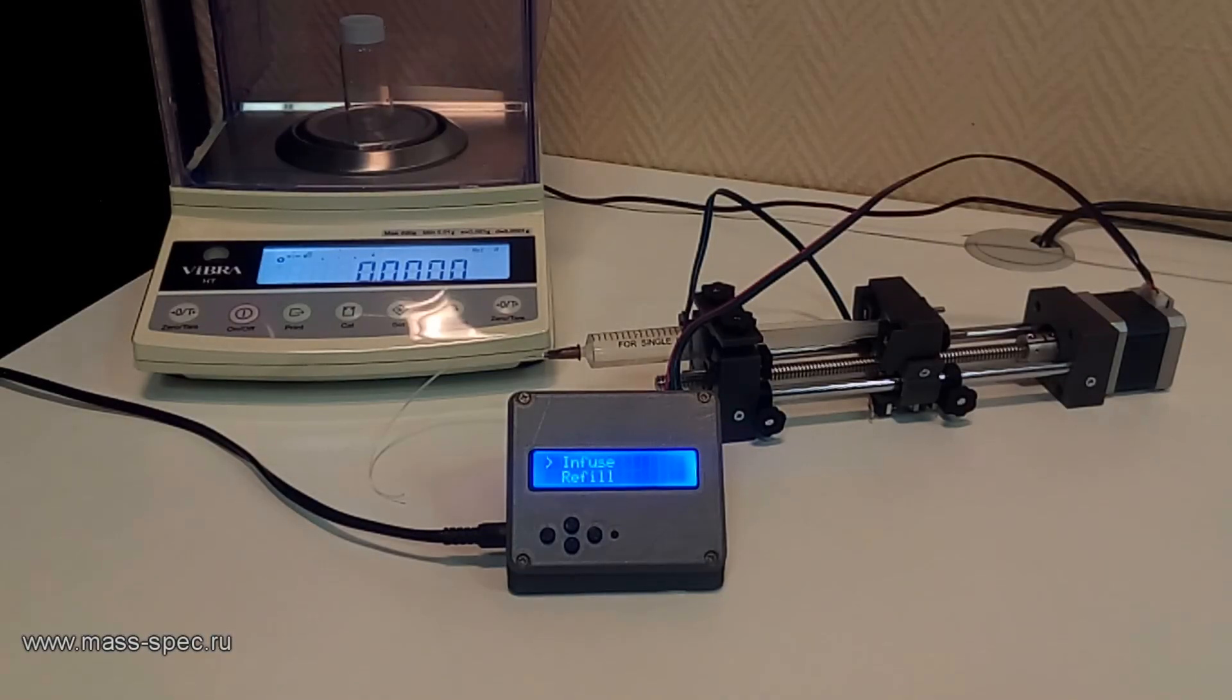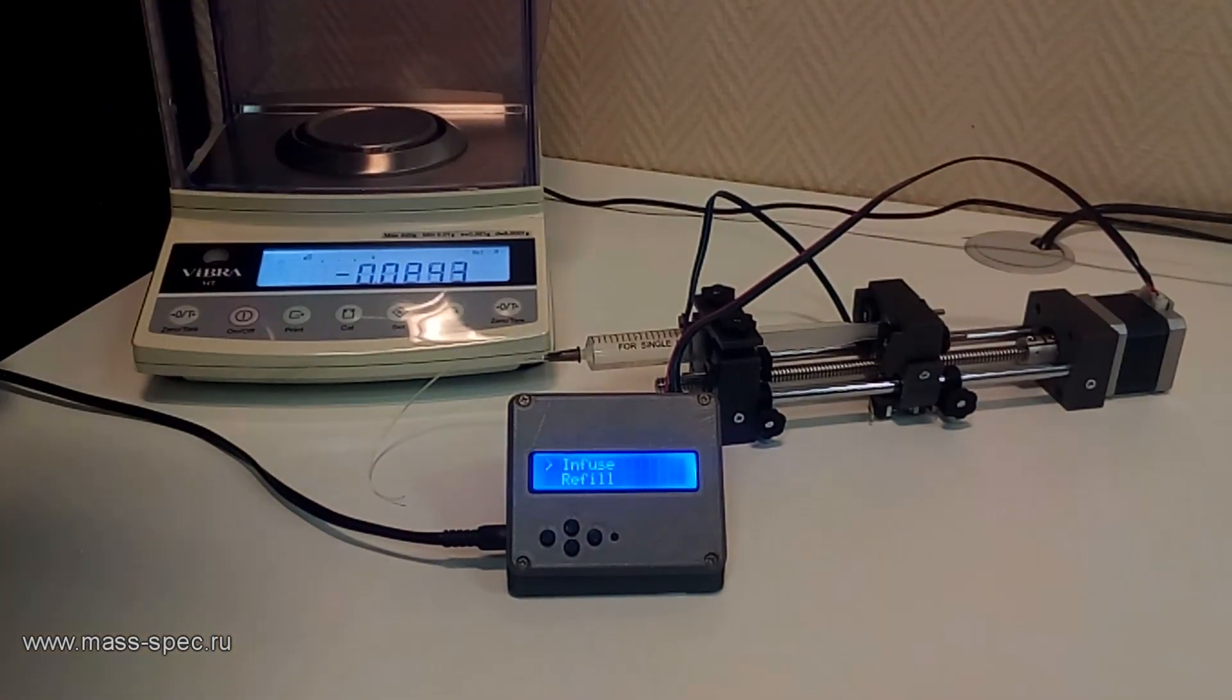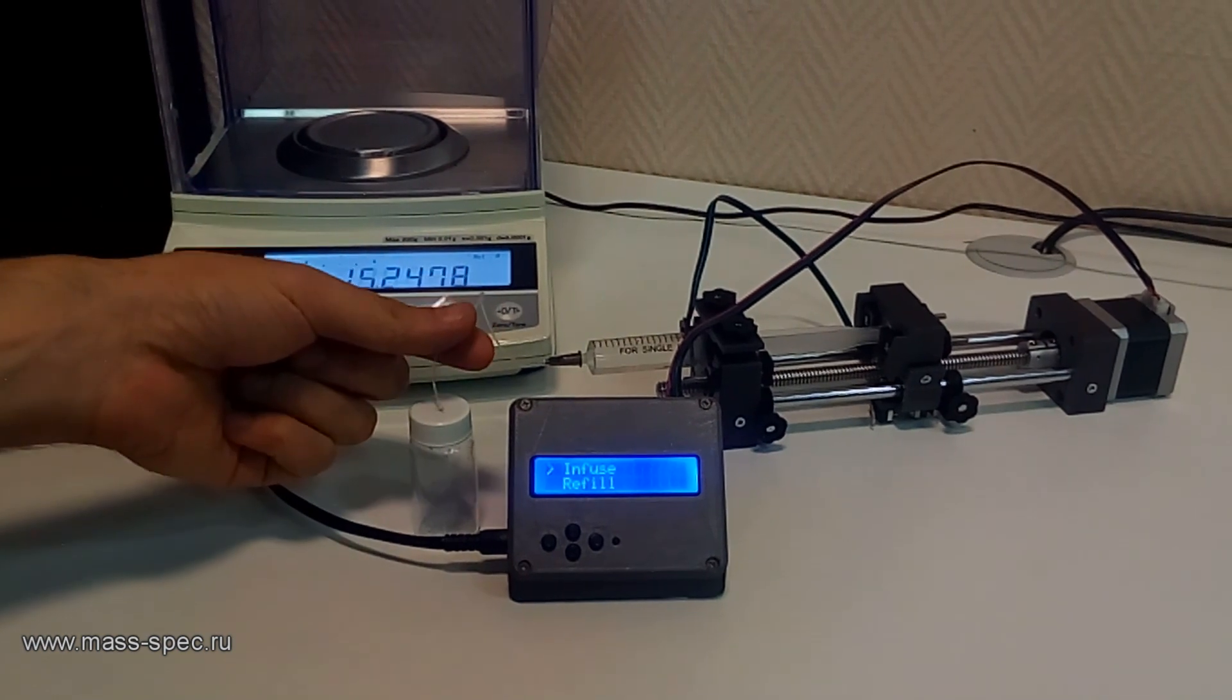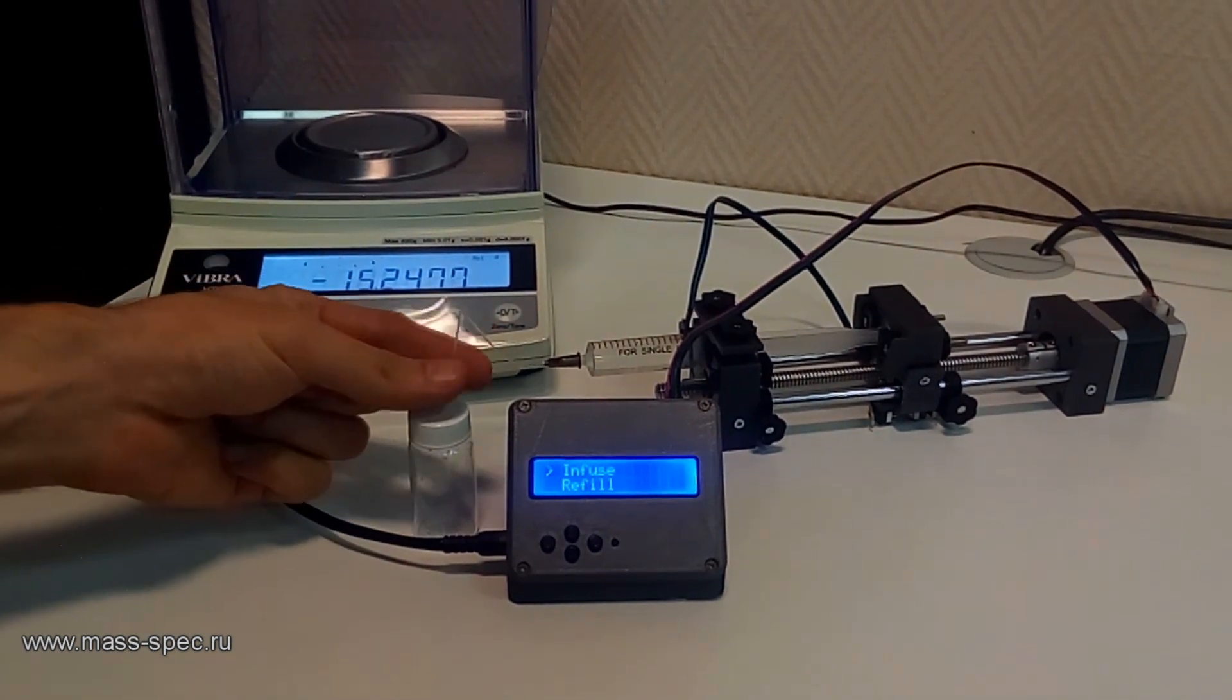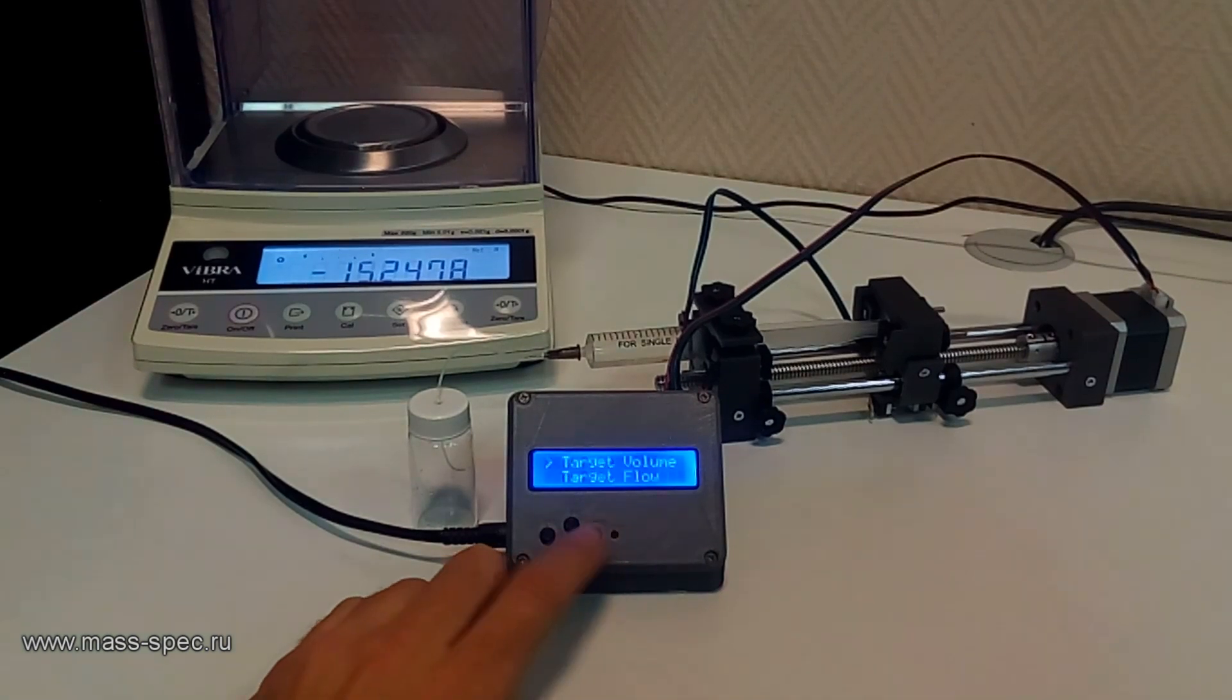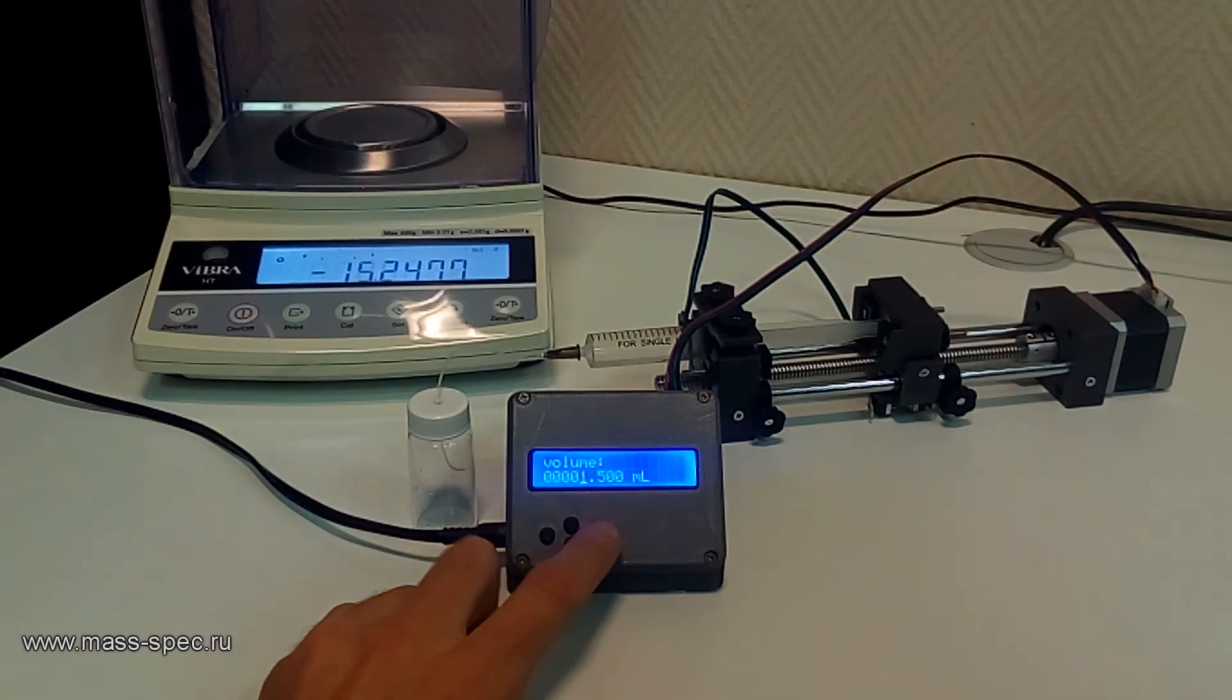Now it is possible to evaluate the accuracy and reproducibility of the syringe pump. A 10 milliliter syringe was filled and several 1 milliliter aliquots were dispensed.